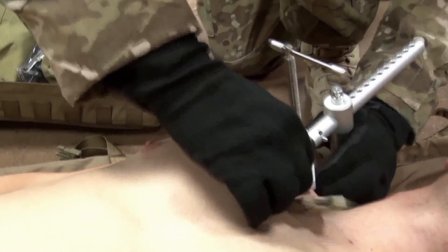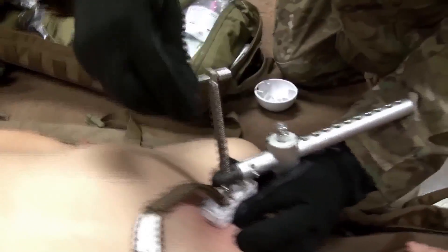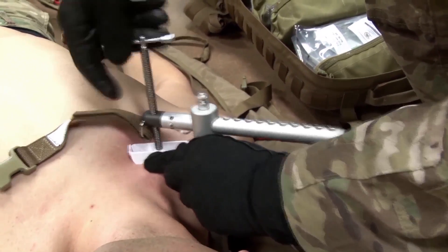Position the base plate under the patient beneath the scapula. Ensure the vertical arm is in contact with the patient on the wounded side in close proximity to the wound location. Ensure the pressure disc parallels the clavicle at the proper angle. Apply pressure by turning the T-handle clockwise.